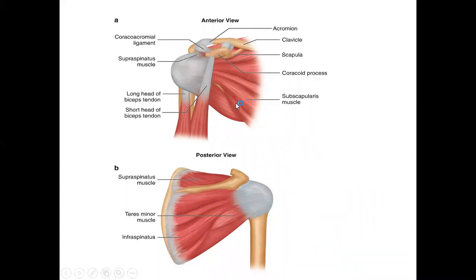And then anteriorly, we've got the subscapularis muscle, the only muscle which can be appreciated anteriorly. It's the subscapularis muscle, and they all join. You can see this band that is just here, which is so key. This is the band of the rotator cuff. They all come and join here to stabilize this joint.